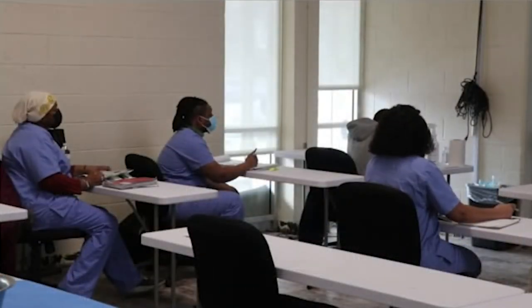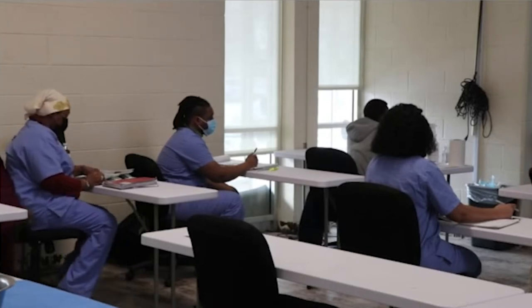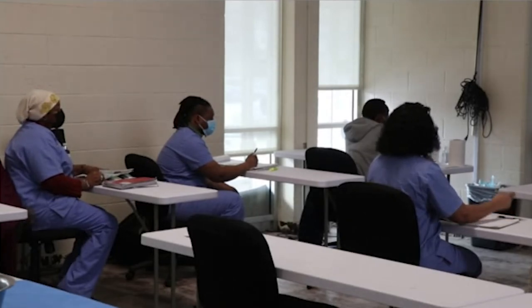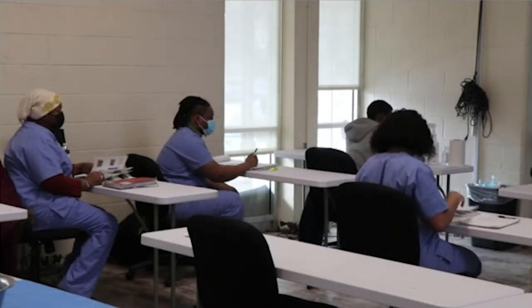We fight over the first closet that becomes empty. The other thing, additional labor may be required to clean containers between use. This is where you guys really show off, because you're able to push containers, instruments, and case carts through. Filter retention plates could become dislodged. We talked about that a little bit, true?